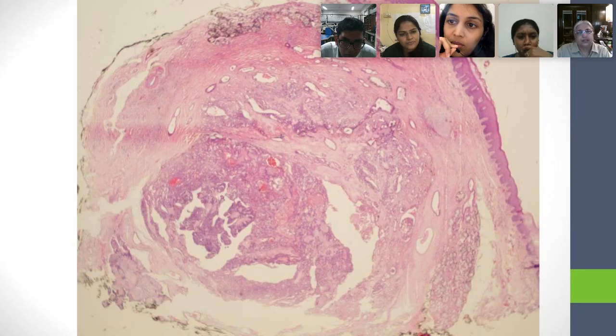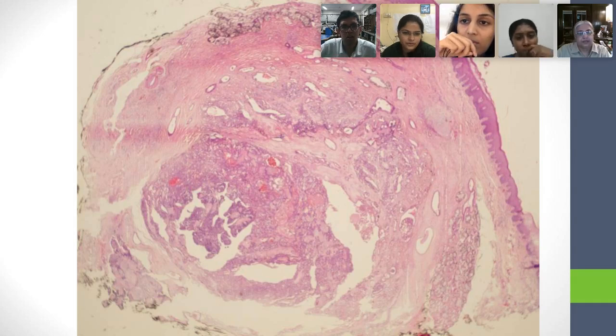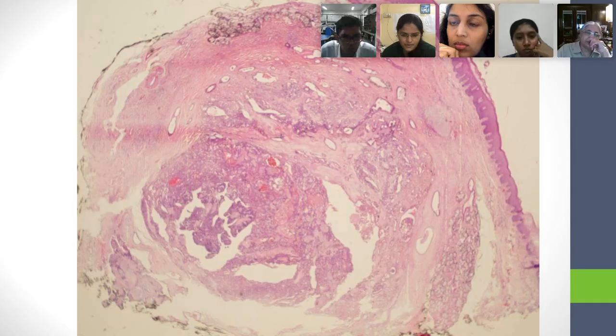You've got an intact palatal epithelium on top. Squamous epithelium. And then in the subepithelial tissue, you have this tumor. And what is it composed of? And if you say glands, Ashish, I will shoot you. What is it composed of? What are all these structures that you are seeing here? They have to be ducts. No, they're not glands. Ducts, ma'am.